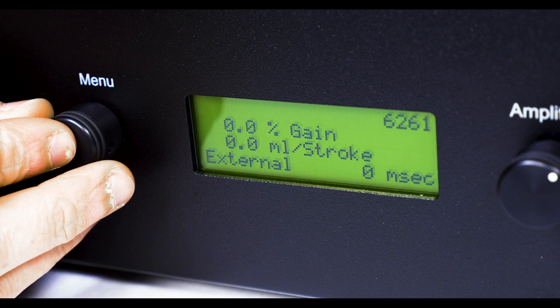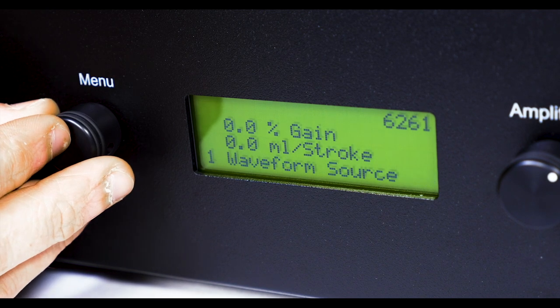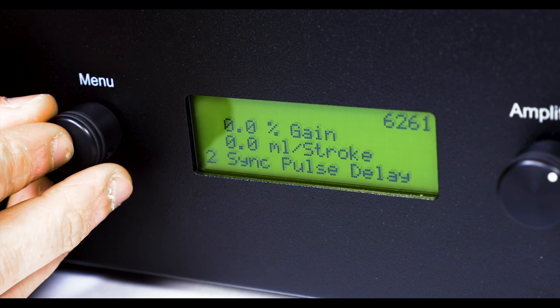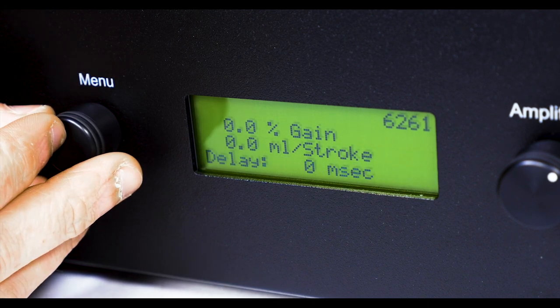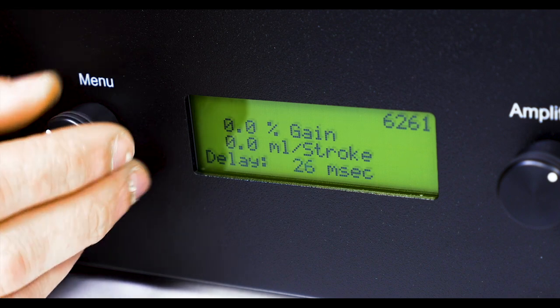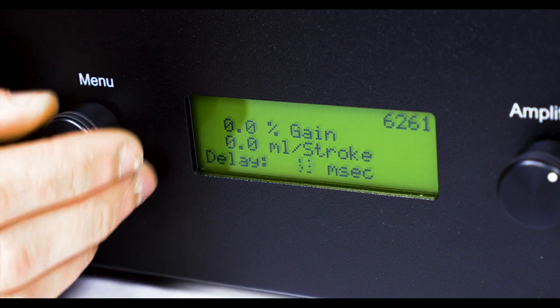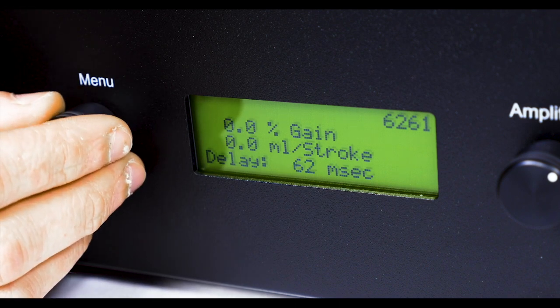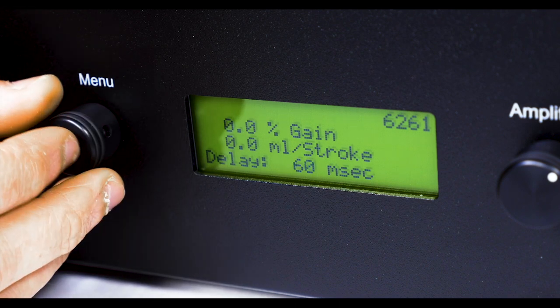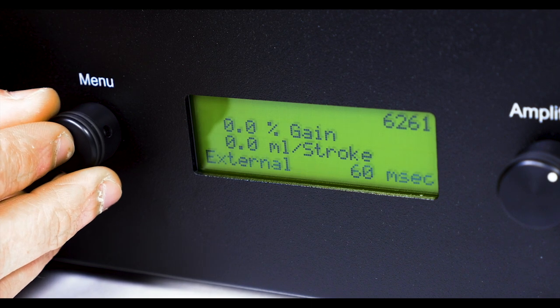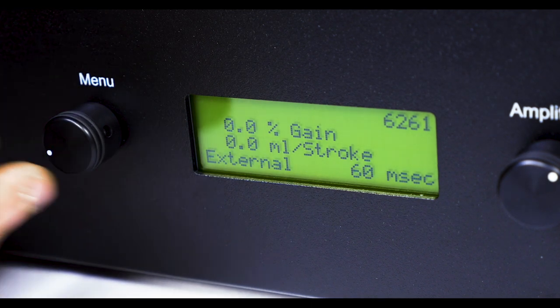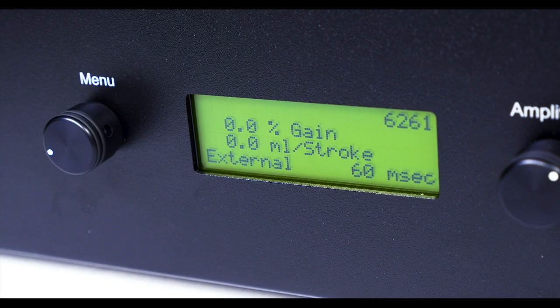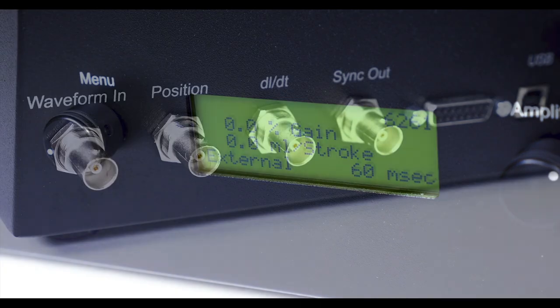The menu dial is used to select from internally stored or external waveforms and adjust sync pulse trigger output delay. This is useful for synchronizing other equipment such as high-speed cameras or data acquisition systems. It can also set the cycle counter.